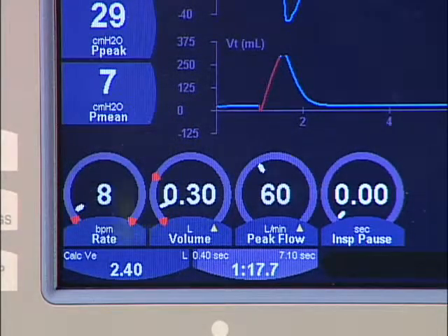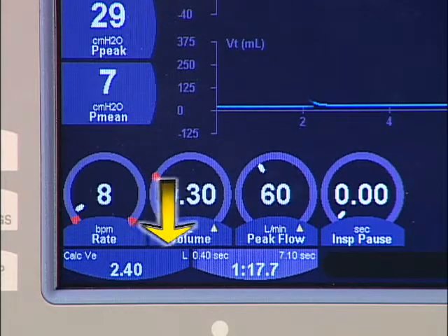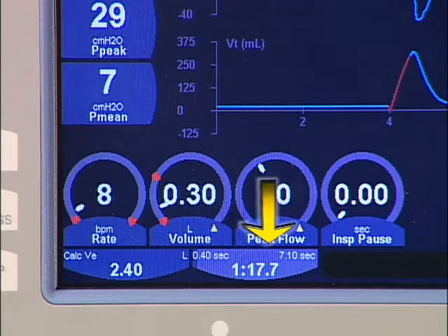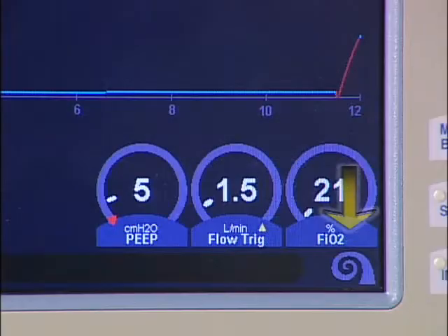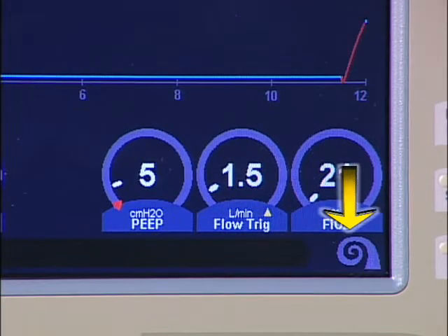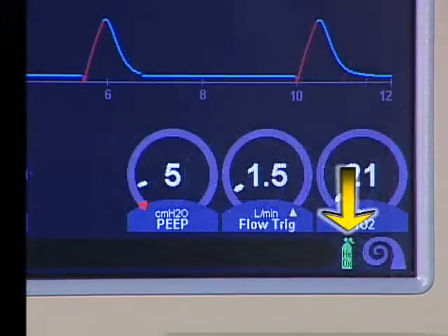Calculations for minute volume, inspiratory time, expiratory time, and I to E ratio are displayed at the bottom left of the main screen. Compressor operation is displayed as an icon in the lower right corner of the screen. The indication of battery operation is also displayed here. If Heliox is being administered, an icon indication is also displayed in this area.